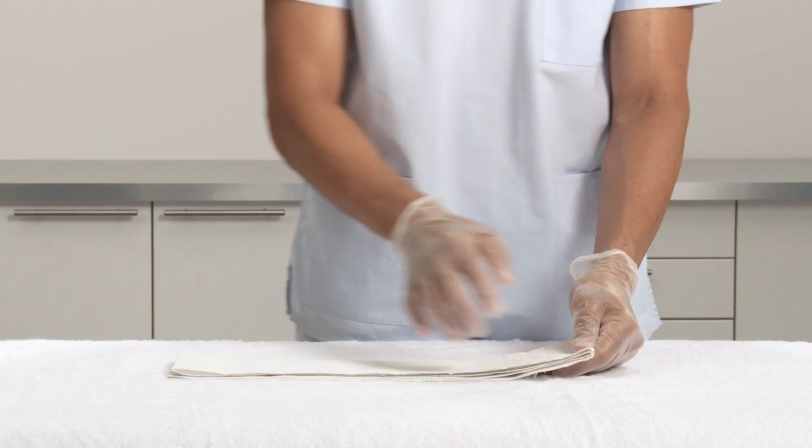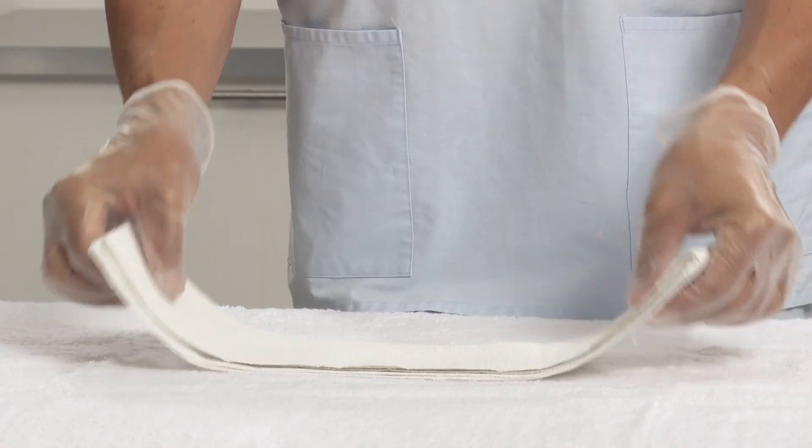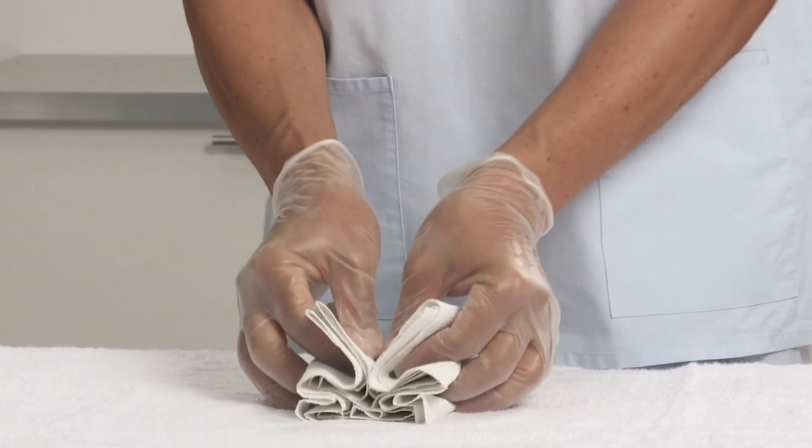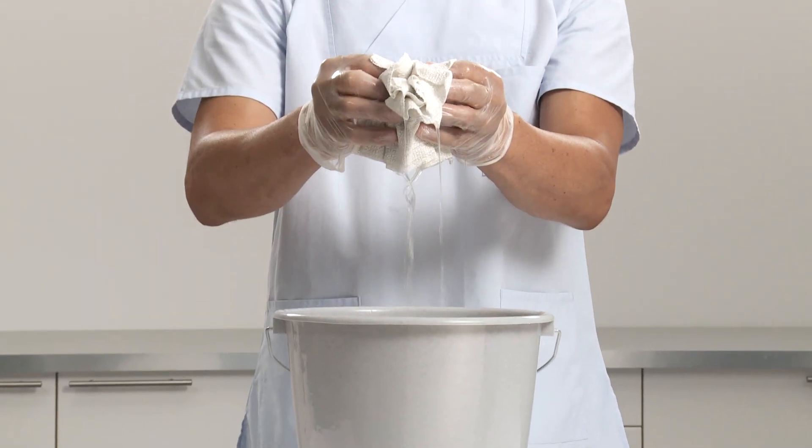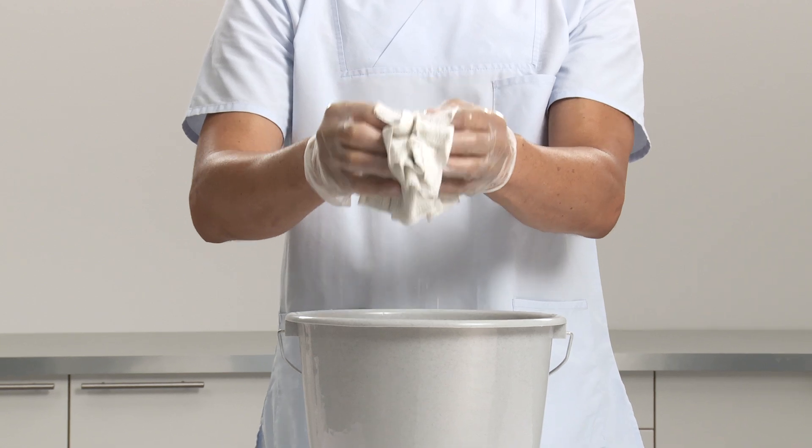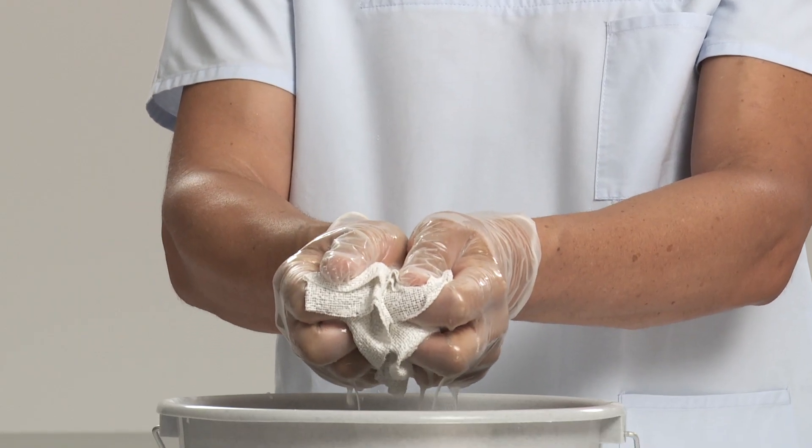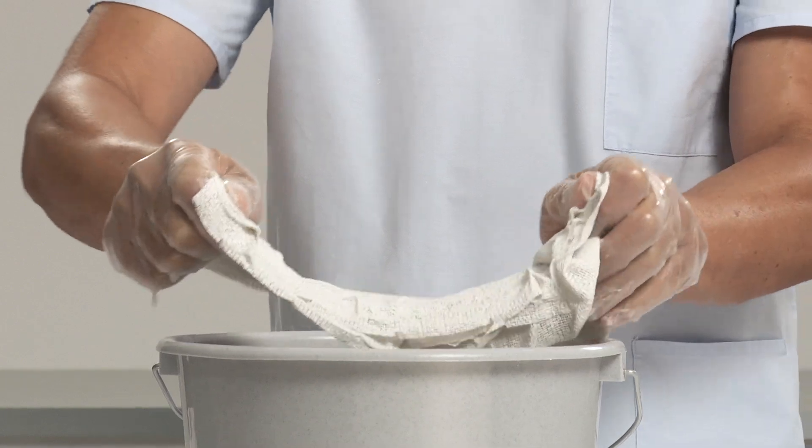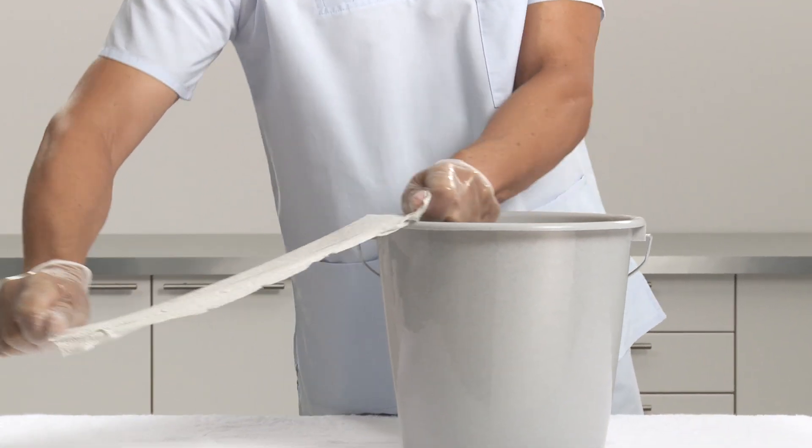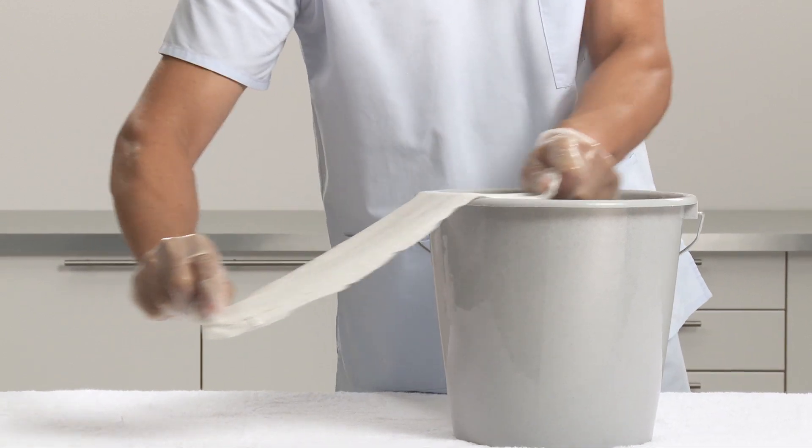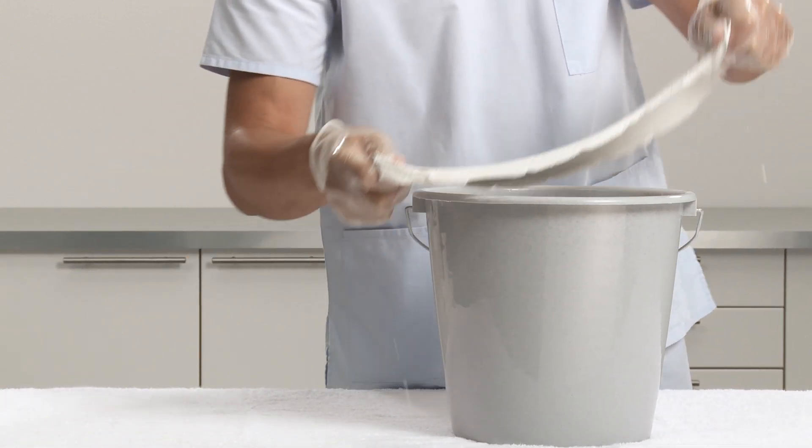Pick up the bandage in a zigzag shape. Activate the splint by dipping into cool water, holding the ends and maintaining the splint fold. Remove from water and gently squeeze to drain. Straighten out the splint and run it over the edge of the bucket to smooth and dispose of surplus water.